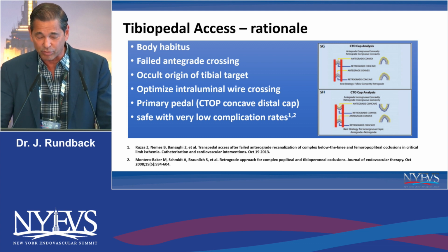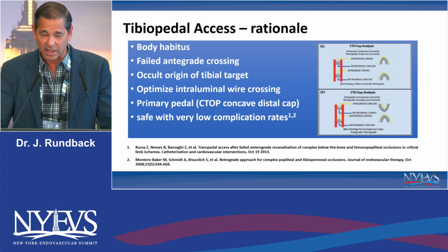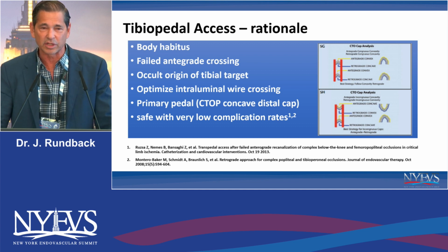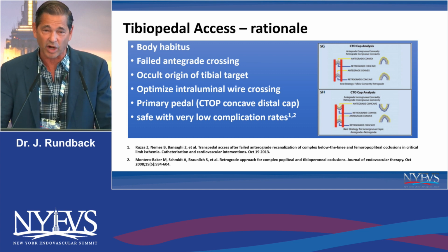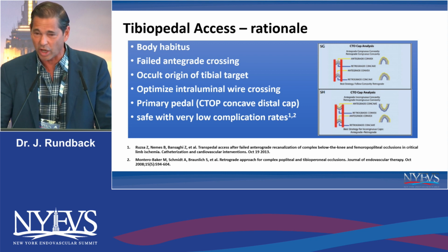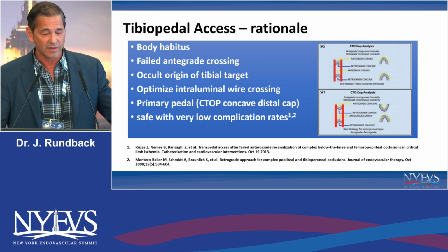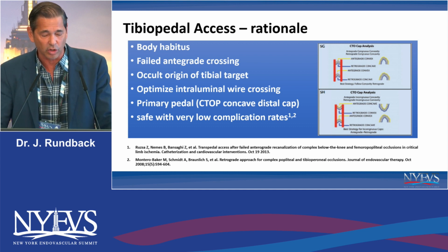Then there's the whole idea of sort of primary pedal. When you get these cases where you just know from imaging or baseline angiography that it's unlikely you'll cross antegrade, we don't utilize a primary pedal per se, doing direct foot stick, but there are cases for a variety of reasons where that is the best approach. It might be a body habitus sort of issue or prior intervention failure, where we'll just bring them in with the intent to do the procedure from the foot, although that will, of course, require a larger sheath.